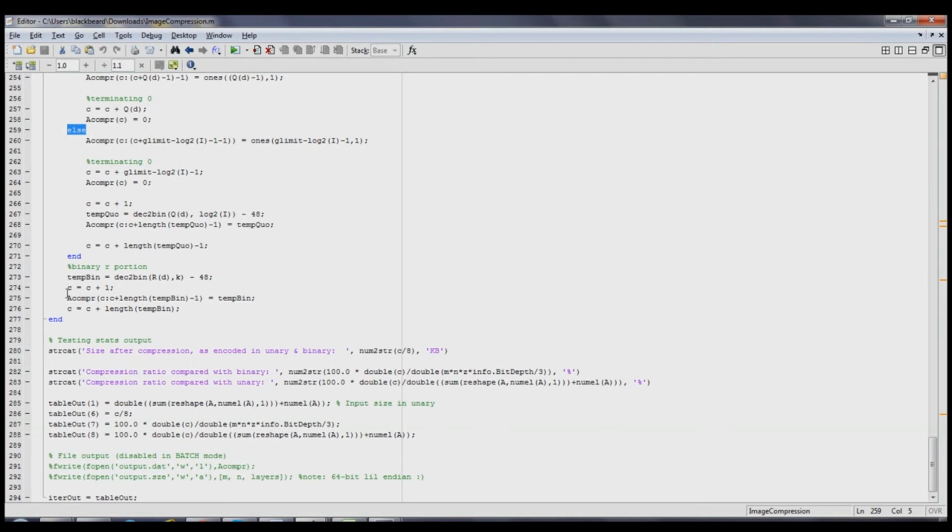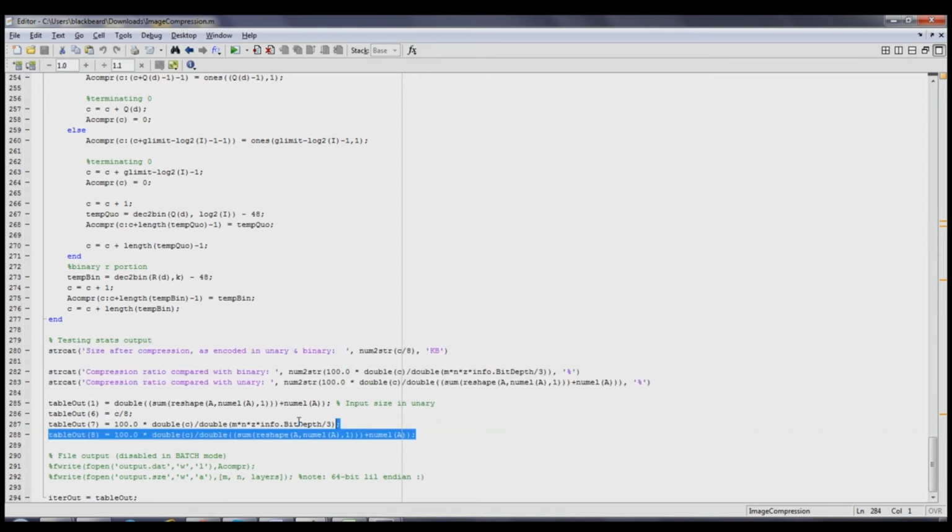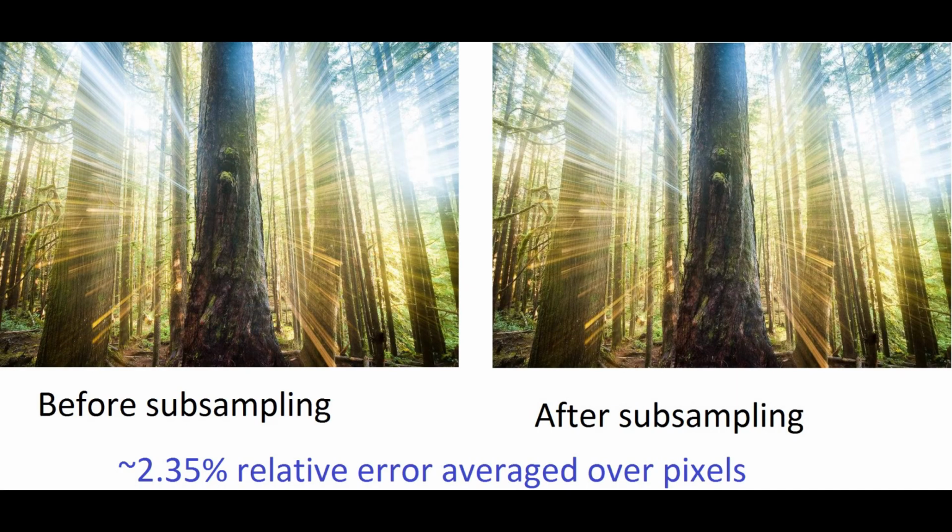Increment file cursor. And lastly, once the file is encoded, the benchmark stats are computed for the final file size. All stats are outputted in a table row, which in batch mode will be appended to a spreadsheet. In 300 lines of code, we produced a readily benchmarkable implementation of Khan's algorithm.